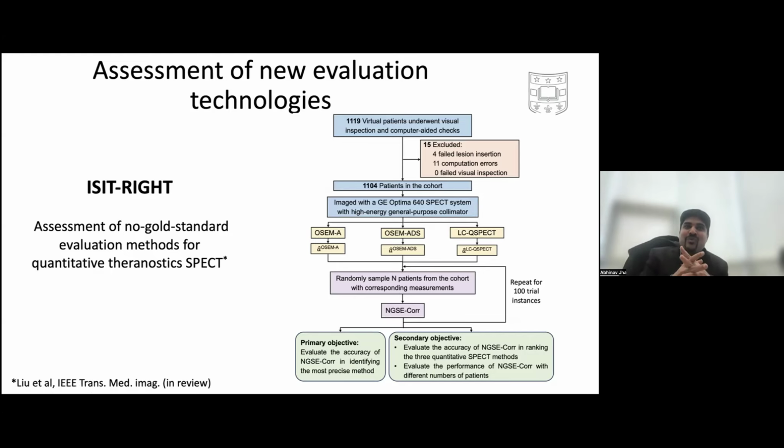This was one trial where talking with the biostatistician was very useful, because we actually did a lot of numerical studies in order to identify the size of the patient population that we need in order to assess whether our methodology gives accurate rankings, because rankings are a nonlinear function of the activity value. So it was a lot of simulations that we did to do the power analysis. What's the task? You're evaluating what exactly? We are looking at ranking performances. Ranking of what?